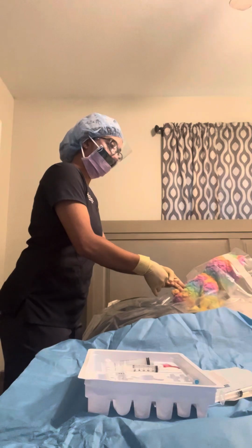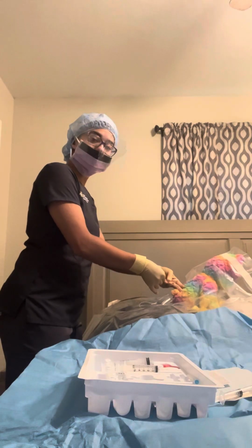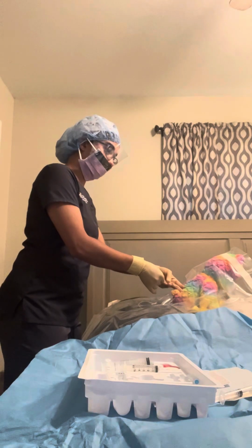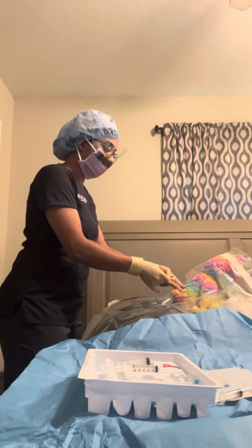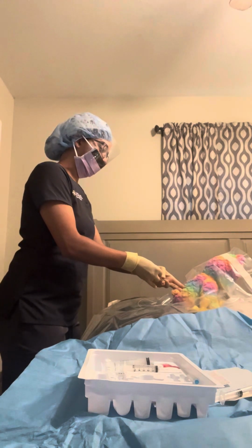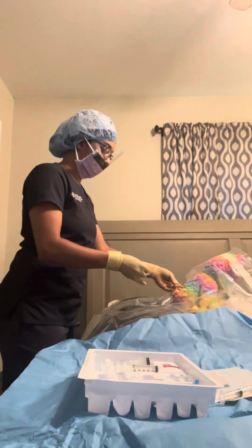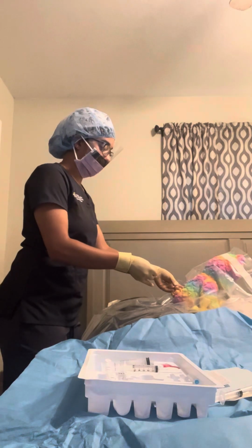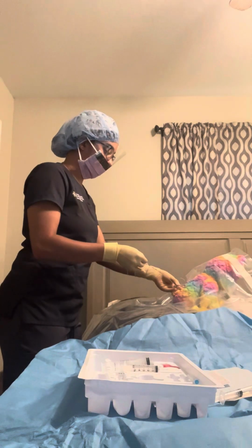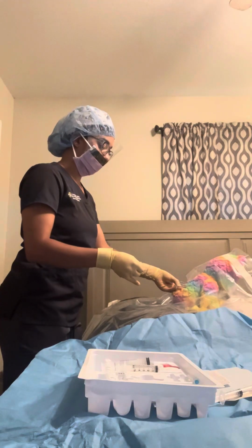I'm going to thread the epidural catheter in 4 to 5 centimeters past the mark of where I noted the loss of resistance on the needle. We're going to say this is about 10 centimeters. While still holding on to the catheter, I'm going to withdraw the needle. To not contaminate the epidural catheter, I'm going to slowly withdraw the needle and loop the catheter in my non-dominant hand. Make sure it stays on the sterile field.